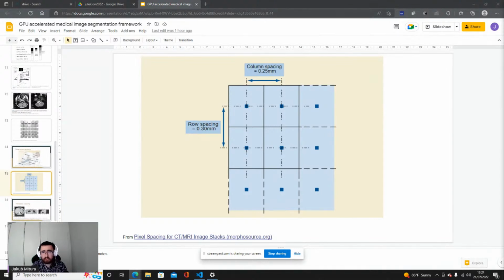Why are they not just ordinary file systems? Because we need this metadata. I just mentioned the most important from a practical perspective: what is the origin, what is the direction, what is the spacing. But there are more. For example, it is written what the patient's gender is, what series we have, what the exact properties of the current were that was used to generate the image, and what the device was exactly, because it can matter.